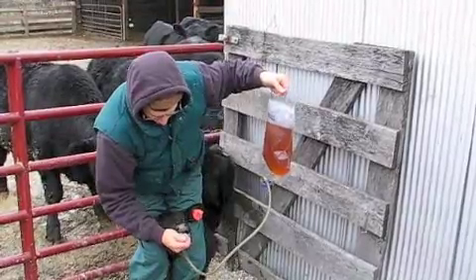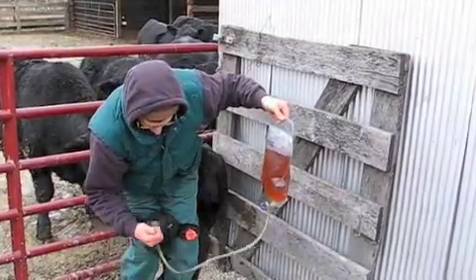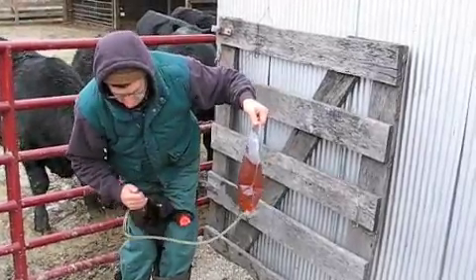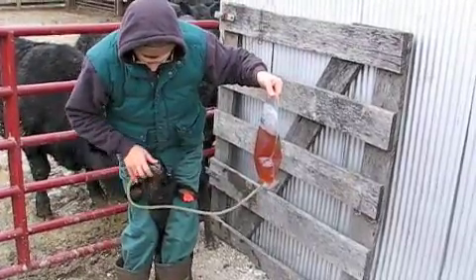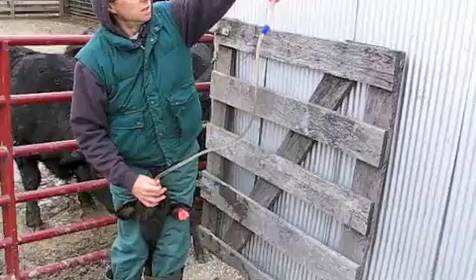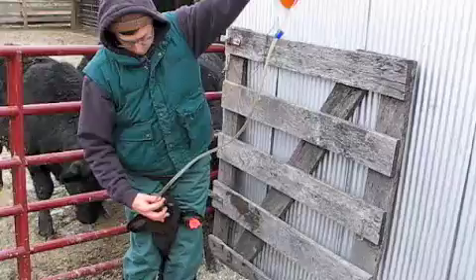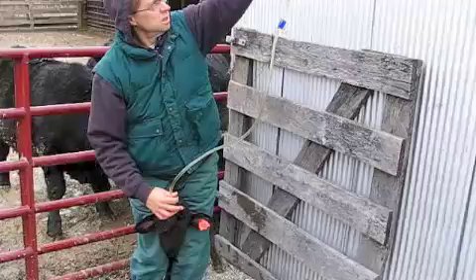He's going to finally swallow it. They usually jump a little bit — bury the hard part of the tube clear to the teeth. That's the key to know that it's in their stomach. Lift it up and let it fly. You'll see the hard part of the tube is right at the edge of his teeth. That's really important.